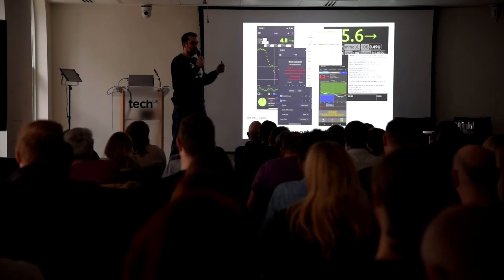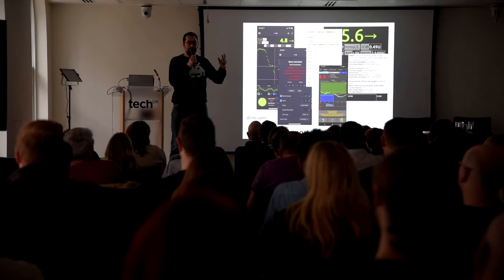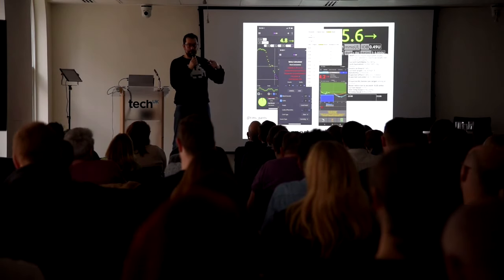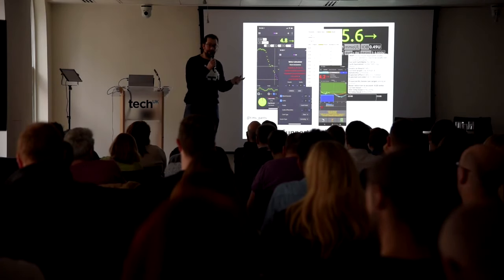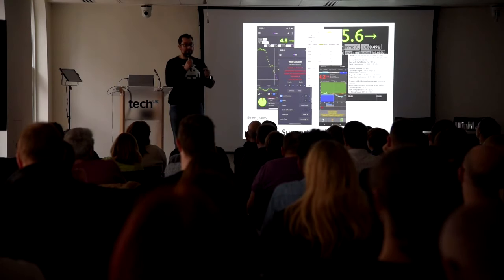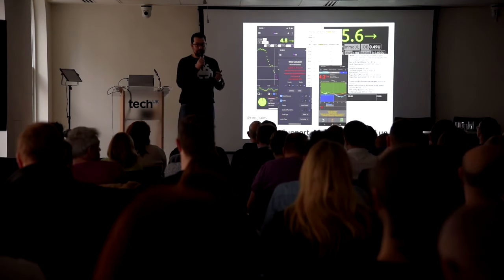But what it does do is it gives you a reasonable prediction or guess, depending on what term you want to use, of whether your basal rates are actually aligned with where they probably should be, whether your carb ratio is where it probably should be, or whether actually you might need to do some work. Now, as always with anything like this, you are the arbiter of whether or not you make changes, but it provides some indication. And we know that it doesn't work for everybody, but you can have a look at it and decide whether you want to use it.